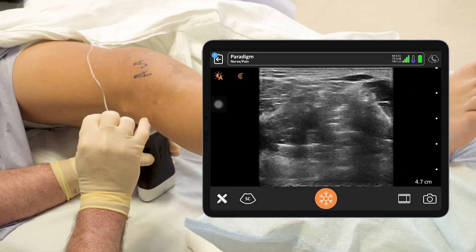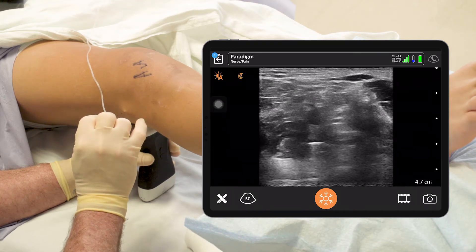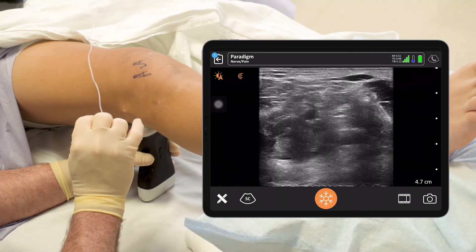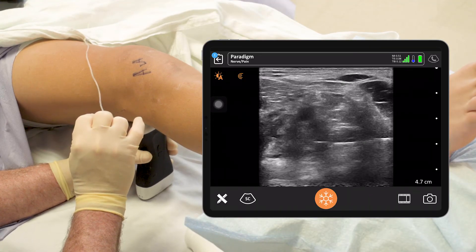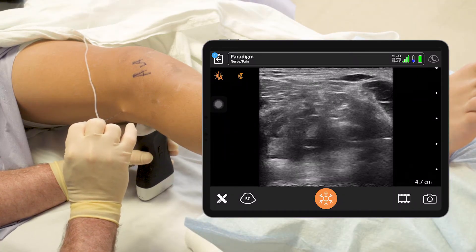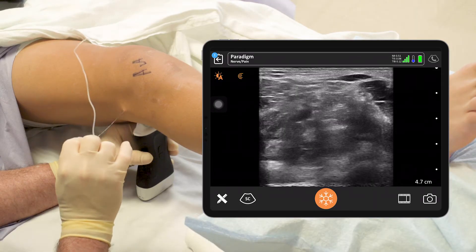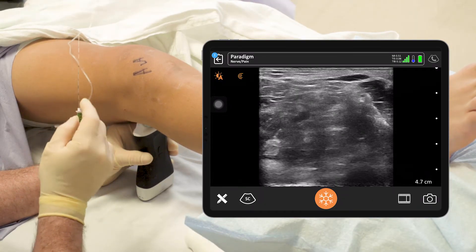Give me five more right here. Let's see the needle really well. Pull back here — three, four, and five. There's five cc's, and give us five more cc's here. One, two, three, four, and five. There's 15 cc's total — that's what we're going to do.